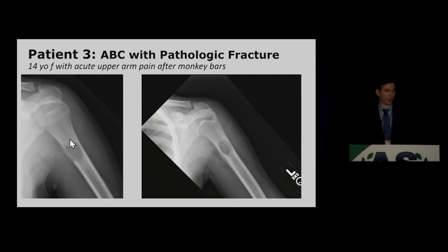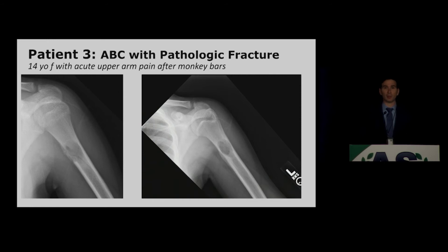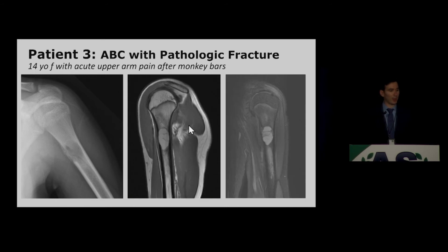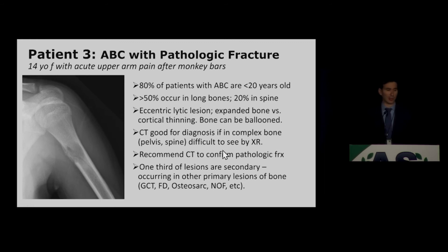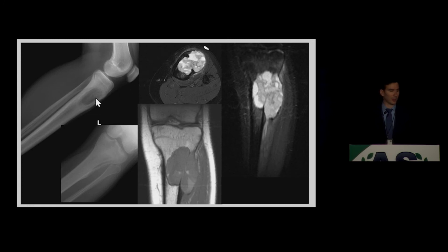Patient 3 is an aneurysmal bone cyst (ABC) with a pathologic fracture. These are eccentrically located with a sharp, narrow zone of transition and often lack a matrix on plain film. In the ED, if you suspect a pathologic fracture, CT is a great modality to evaluate it. These lesions can also occur in the pelvis and spine, and CT is good for further workup when characteristics are uncertain. On MRI, you can see septations and classically layering fluid-fluid levels on axial images. 80% of patients are under 20, and 50% occur in long bones.